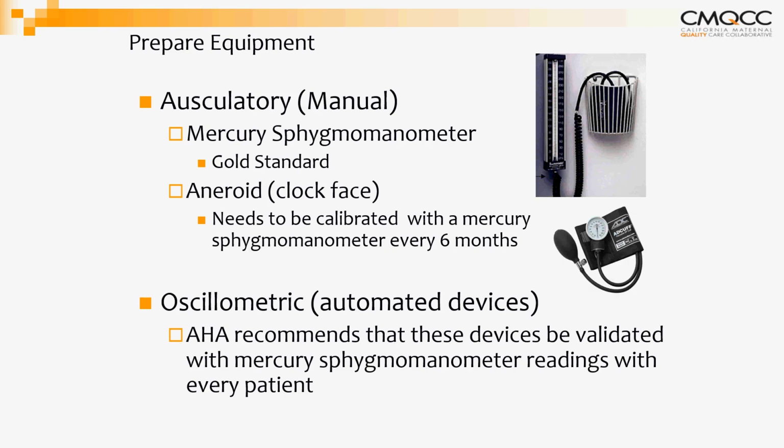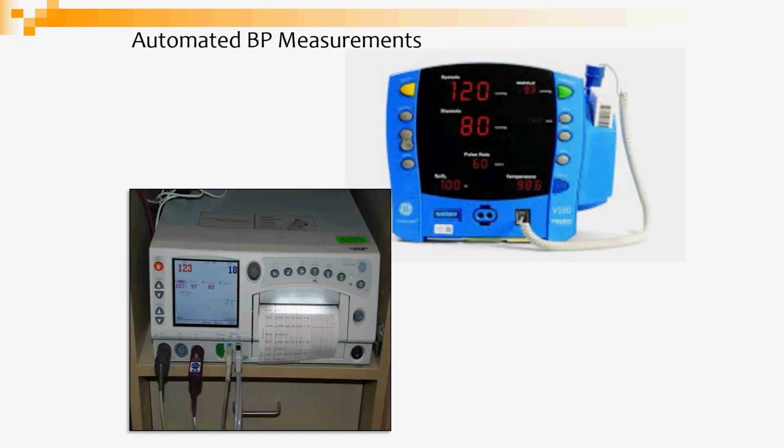To be honest, when you look at the literature and when you look at recommendations, say, from the American Heart Association, it is important to understand that there are variants between the types of blood pressure recording monitors that are used, and you can have a variance of a few millimeters of mercury to more than 10, and of course that can affect how the patient's condition is managed. Next slide.